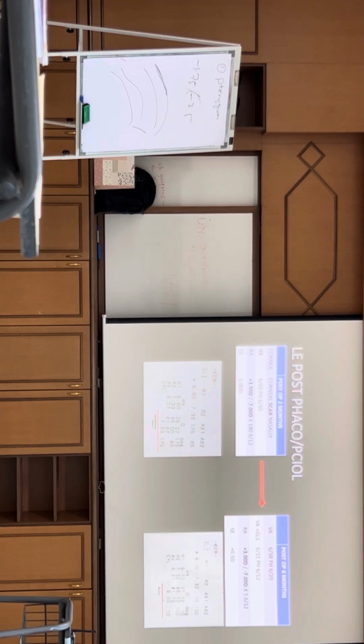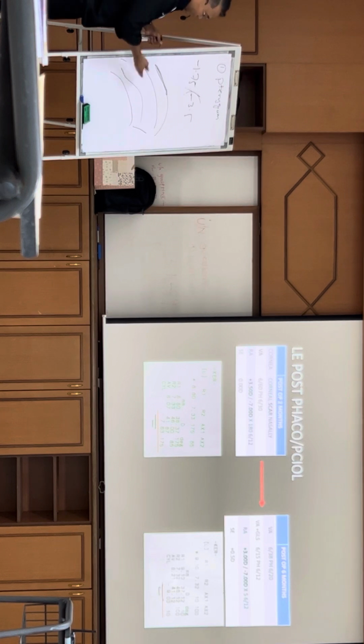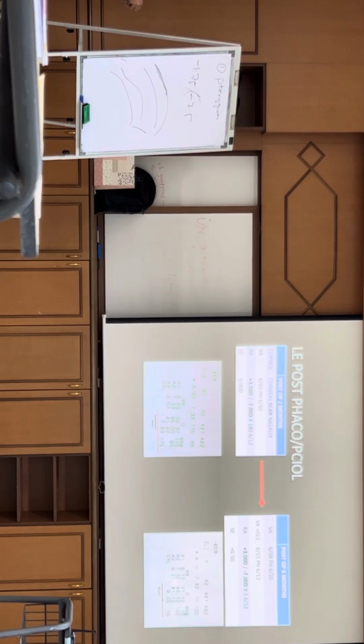Now the question is, the patient cannot afford. You always get that, patient cannot afford. Oh, that's tough. Because you know that whatever that you do, you will have that -7. Now if we do the limbal relaxing incision, it will not actually clear up this particular thing.